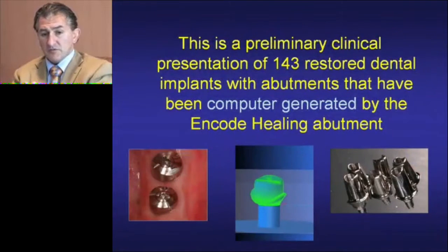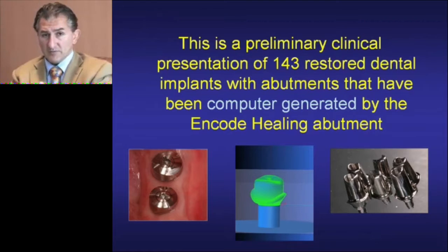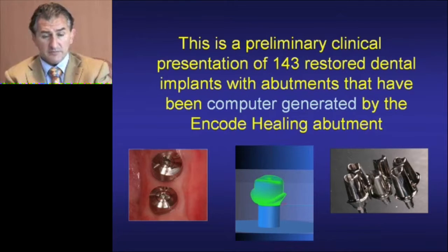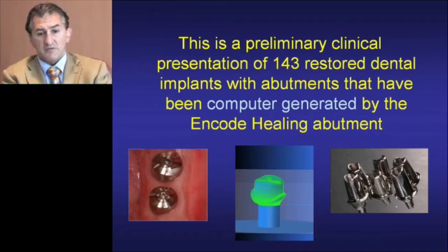We published a 2-year preliminary report in 2007 in PPAD, August of 2007. So this is a follow-up. This is a 5-year preliminary follow-up of a prospective study since that time of 143 restorations that were generated with a computer-generated implant abutment. And how that's done is with the Encode healing abutment from Biomet 3i.